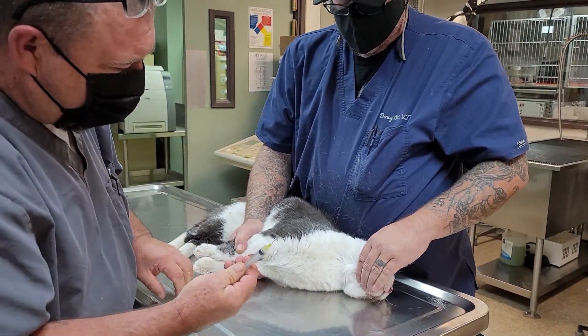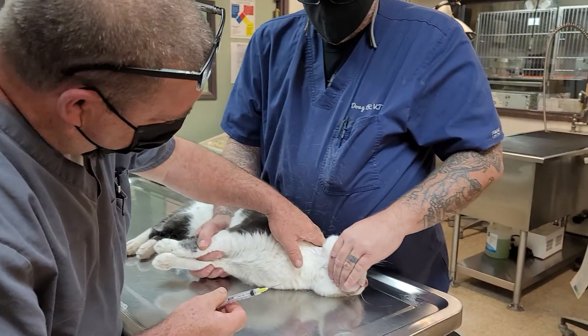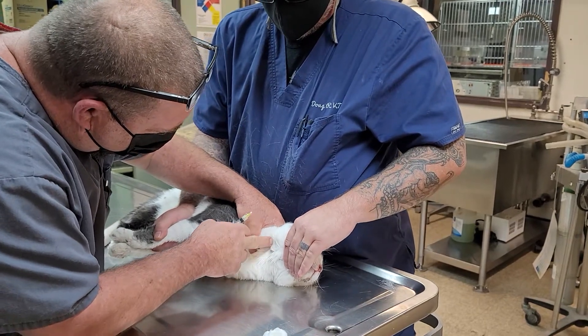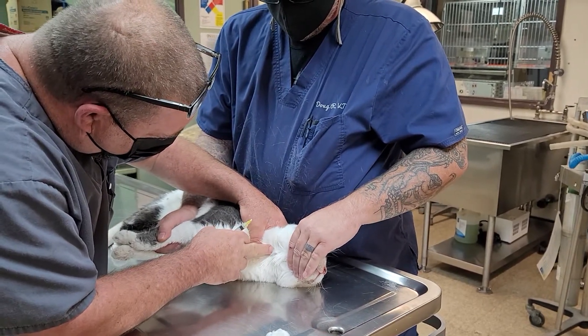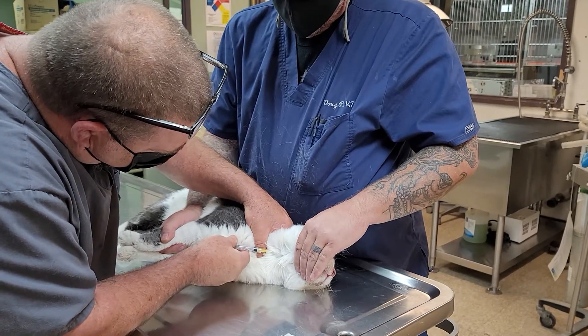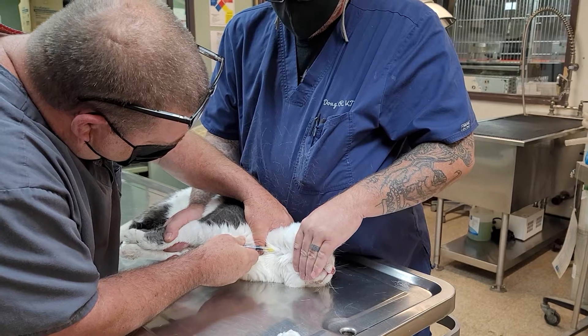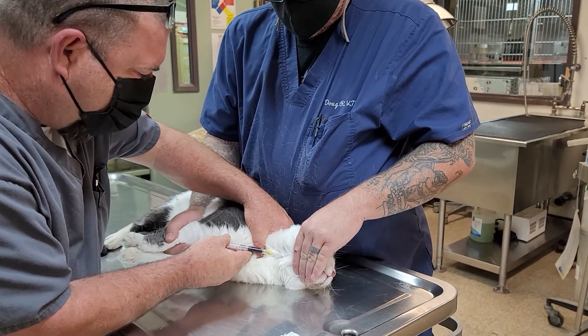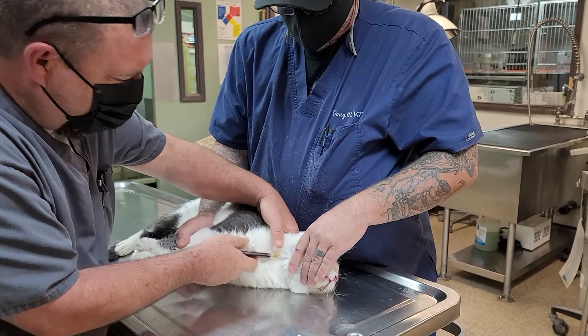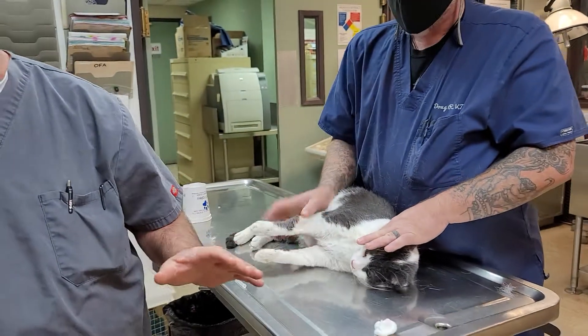Another tip: I use a 20 gauge needle because you're going to get a much, much better sample. The sample will come very fast, so if your cat's reacting negatively, you've got the blood already in a quick fashion.